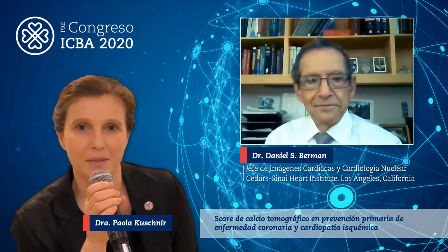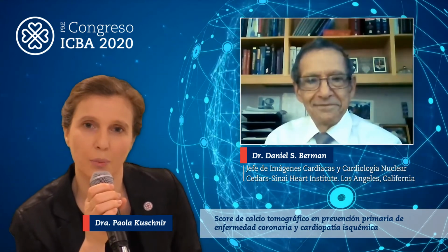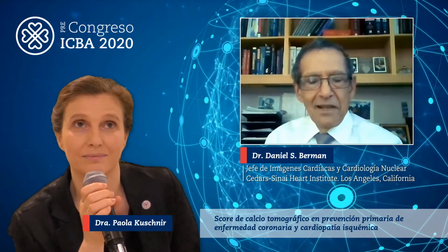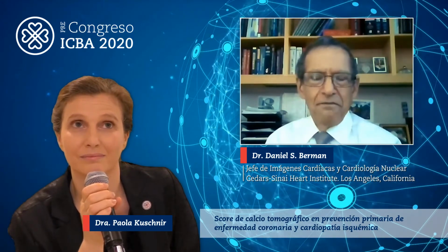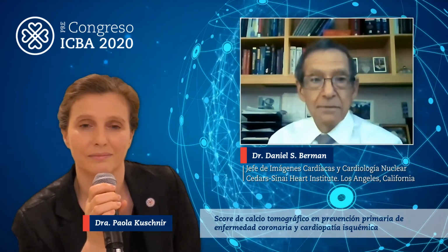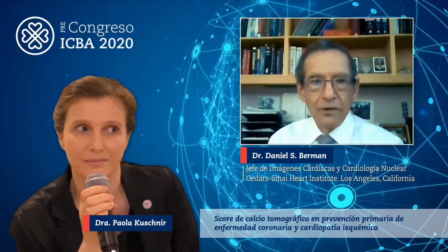How does it help in practice? How do you change your treatment to your patient based on the results? Well, there's a very strong relationship between the coronary artery calcium score, the standard way we measure calcium, and subsequent outcomes.